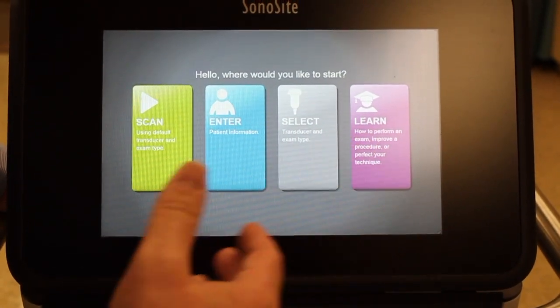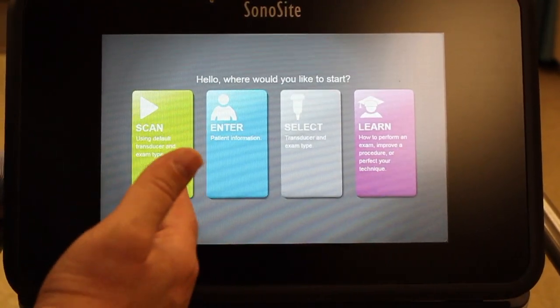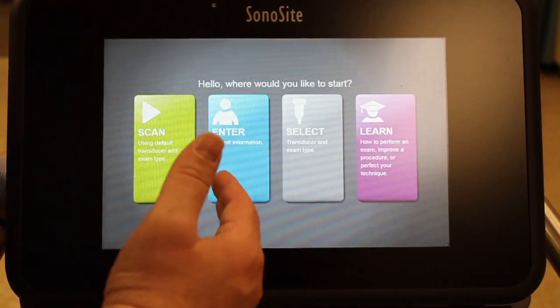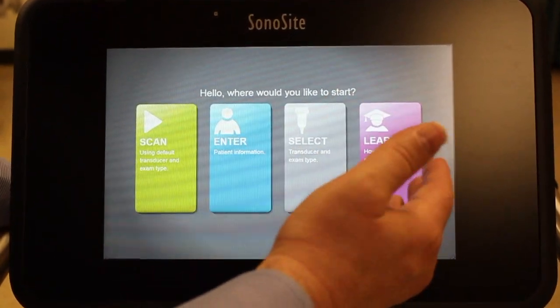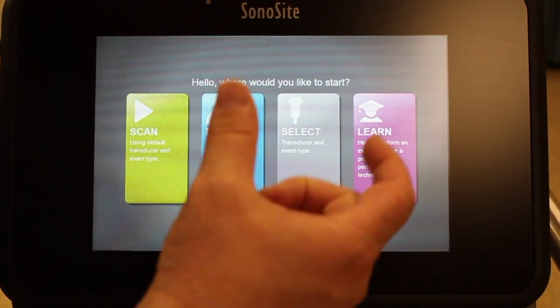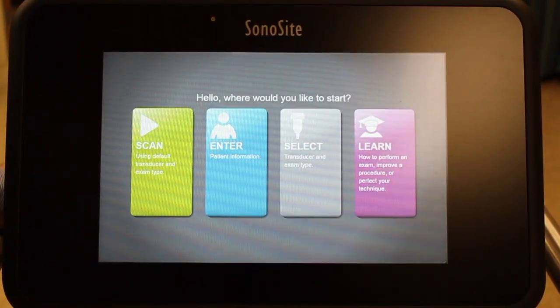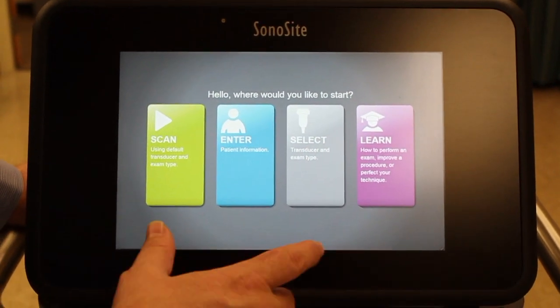When you turn on the machine, you're presented with four options. You can immediately start scanning. You can enter patient information, which we're not going to use ever here in the program. You can select a transducer type — we'll talk briefly about that. And then under the Learn tab, there are some examples or brief videos of how to perform certain types of exams or look for certain structures.